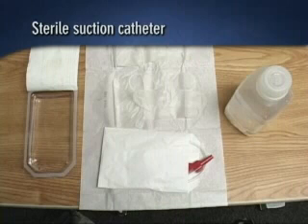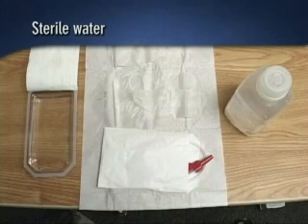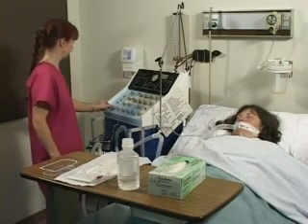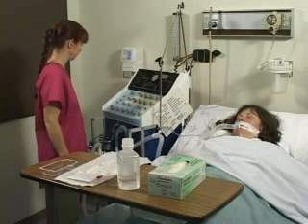After any client care procedures, the hands need to be cleansed. When you are finished and the client is settled, document the change in the client's breath sounds and the client's response to the suctioning procedure. In the event the client does not have an inline suction catheter, then follow these steps. Assemble the sterile suction catheter, sterile gloves, and sterile basin filled with sterile water on the bedside table. Pre-oxygenate the client as described earlier using the manual resuscitation bag or ventilator setting.